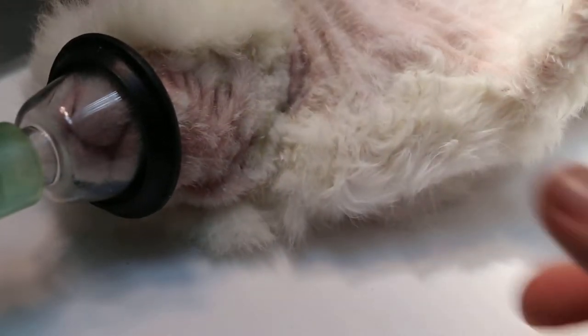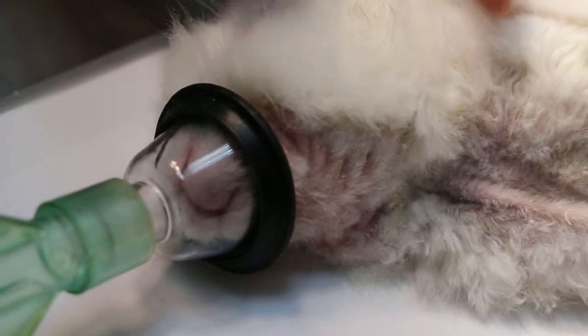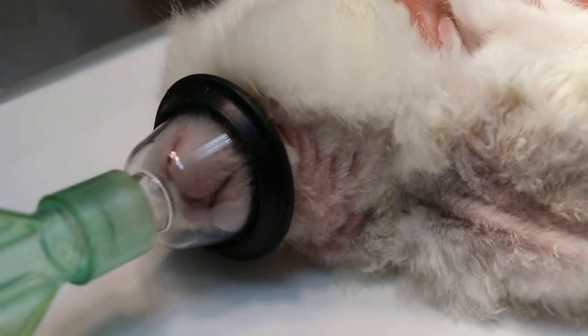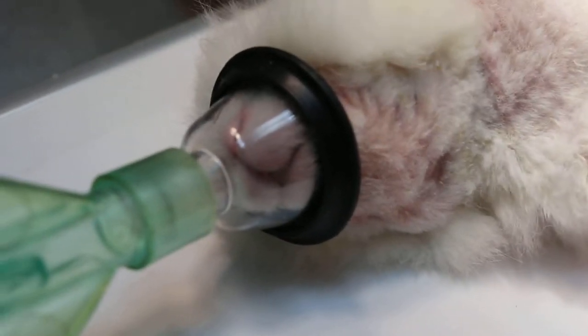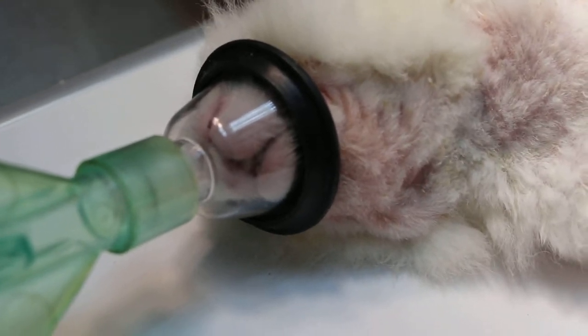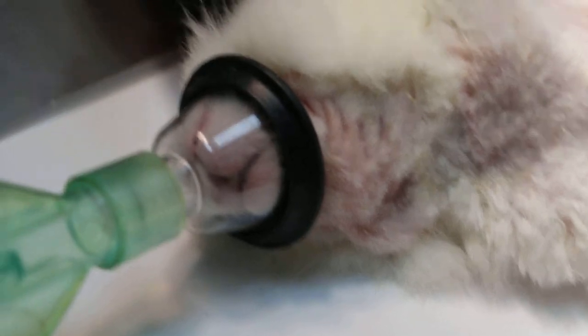Put the rabbit in sternal recumbency. If not, we can do it this way also — just turn out the ventral side. As long as you can get the molars, this will work for the upper one. That way we can do both.